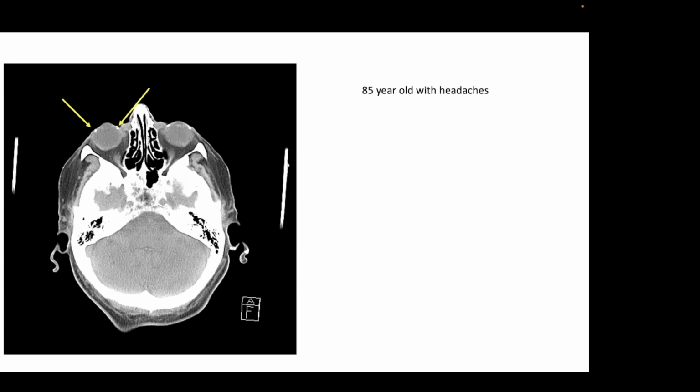I haven't seen it actually, really. Oh, I'm sorry, you've not seen this. I didn't see it in my practice, really. Examining a lot of adults. Yeah. Well, I just want to show this so that we all see this together. This is not all that common, but it's common enough.